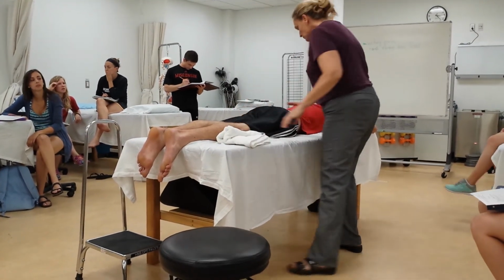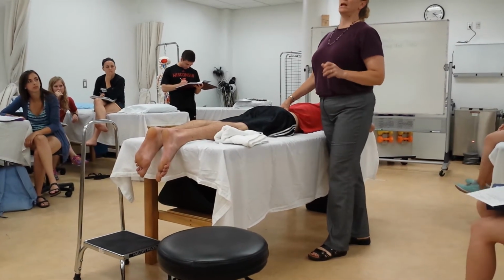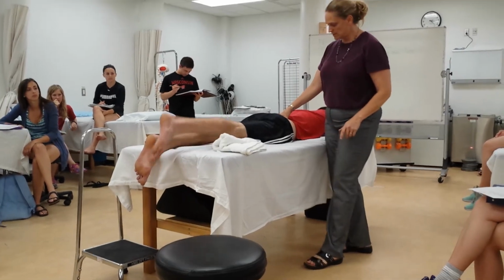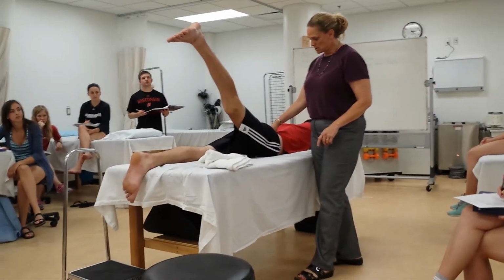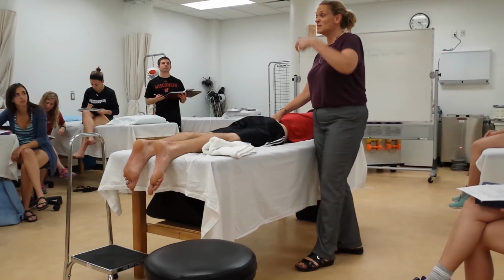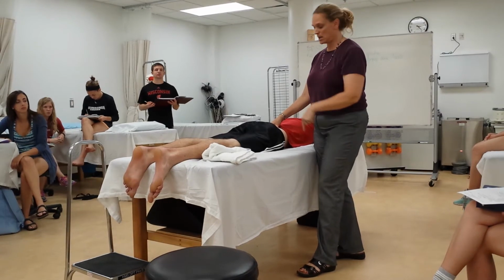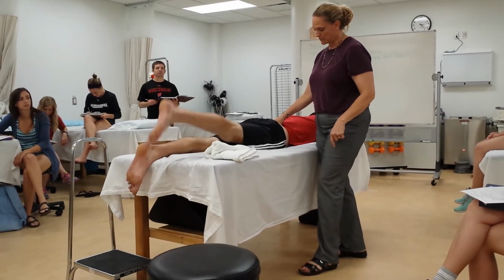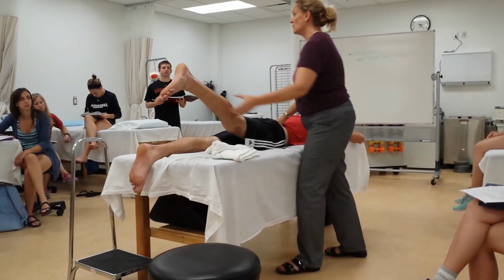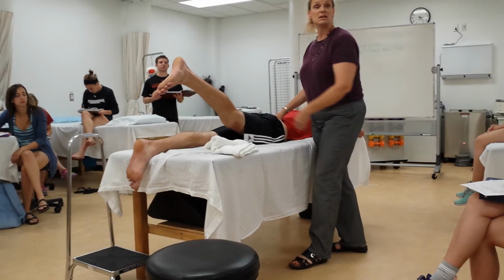Alright. So here again, we really don't want to see him go into an anterior pelvic tilt when he lifts his leg. So I'm going to have you lift this leg up for me, please. Okay. And come on back down. So I'm monitoring his PSISs. I'm looking to see if they go up and anterior. Alright. Go ahead and lift up again. Okay. So right about there before his pelvis starts to move. Alright? The exact same landmarks that I used before.